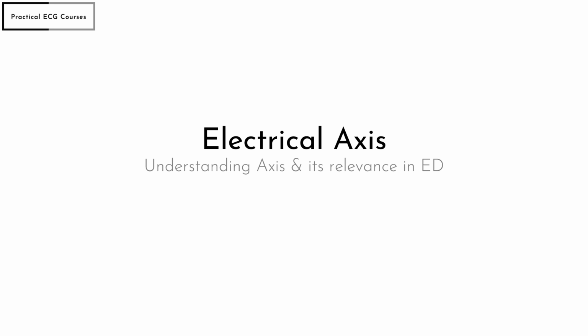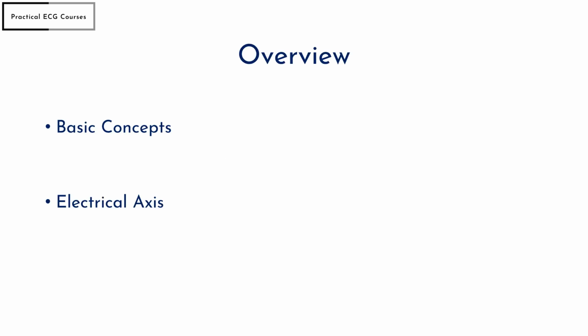While this talk focuses on electrical axis, I will also be introducing some related concepts which will be useful later. Starting with an overview. First, we will cover some basic concepts which you will need to know if you wish to understand axis. Then we will move on to what axis is, how it is calculated, what are the usual causes of axis deviation, and how it is relevant in the ED.